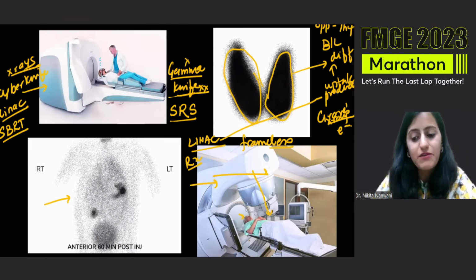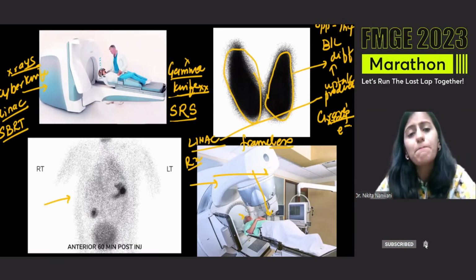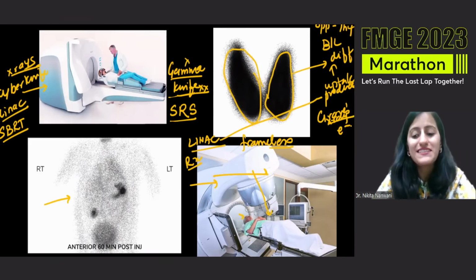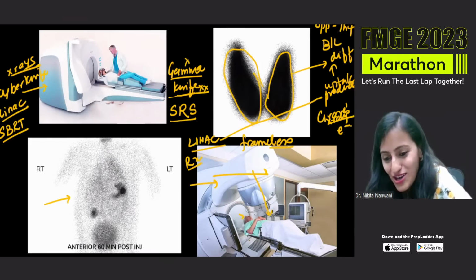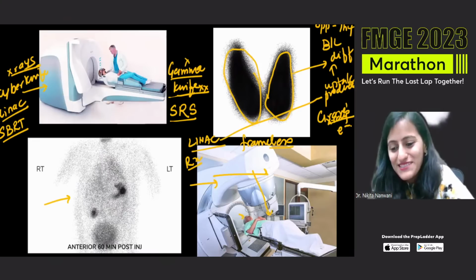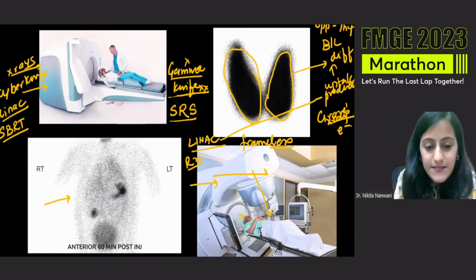Okay. And can someone identify what is this image showing here? In this scintigraphy, what are we seeing? If I tell you that this is a patient who presented with acute pain in the right iliac fossa, what do you think is the diagnosis? Very good. Dr. LRS, correct? And Nani and Prince Davis, I can see you there answering. So what do we see here is this on the left side is the stomach.